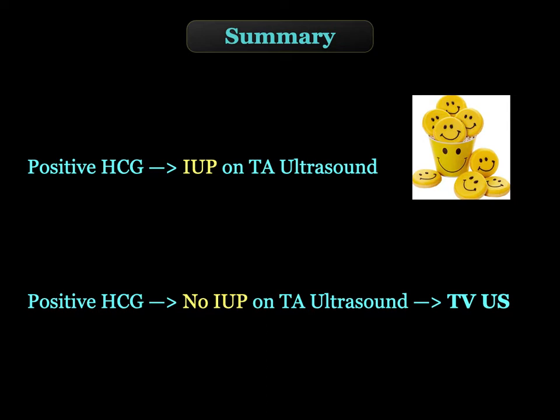They may have a very early IUP, and you were unable to visualize the yolk sac on the transabdominal ultrasound, or they may have an ectopic pregnancy.